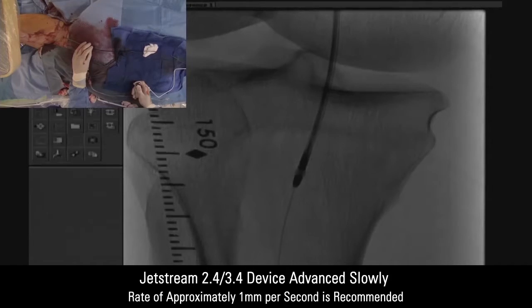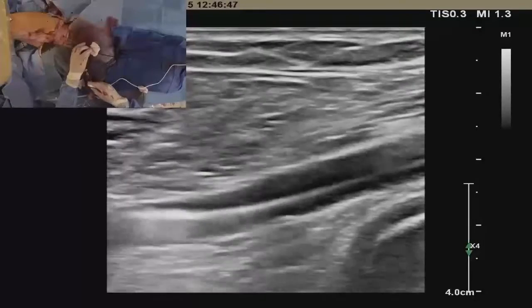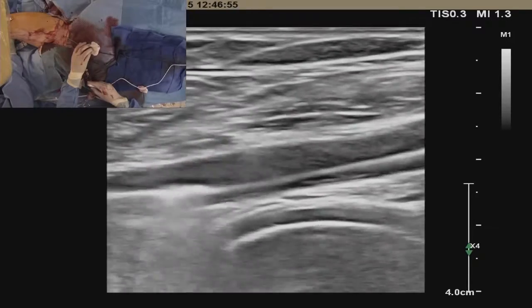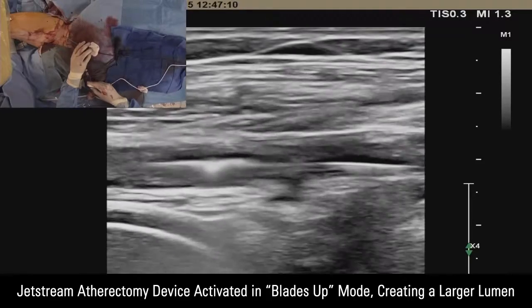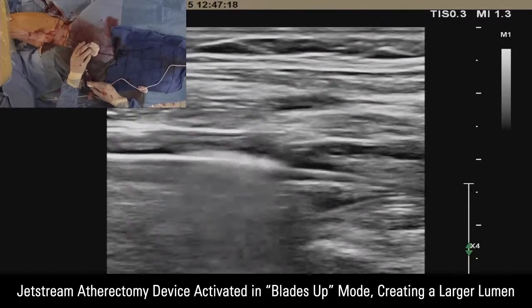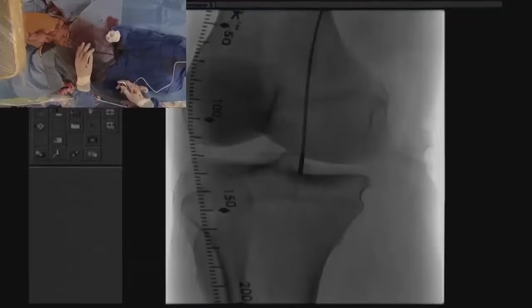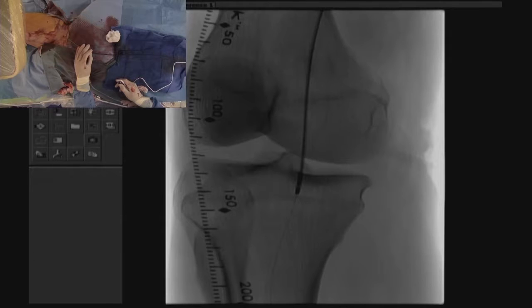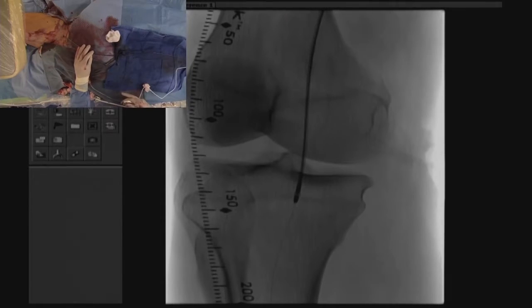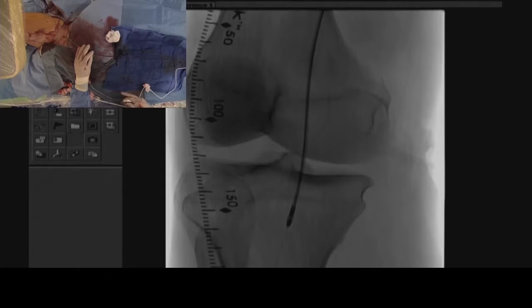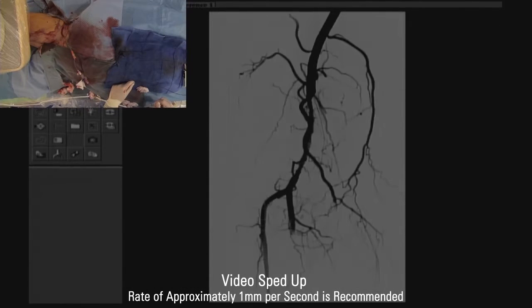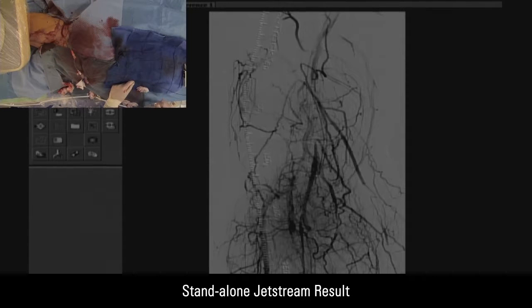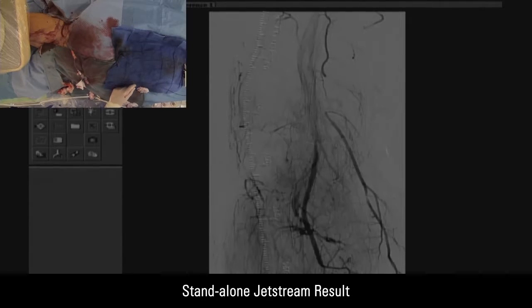You also want to pay attention to the pitch of the device. What you see under ultrasound is what we call the wobbling effect — that signifies there is some space around the tip of the atherectomy device. This is the device being activated with the blades up, creating a larger lumen impact within the vessel itself, being advanced through the atherosclerotic process. This is a post-atherectomy angiogram without balloon angioplasty, and you can clearly see that we removed significant debris from the popliteal segment.